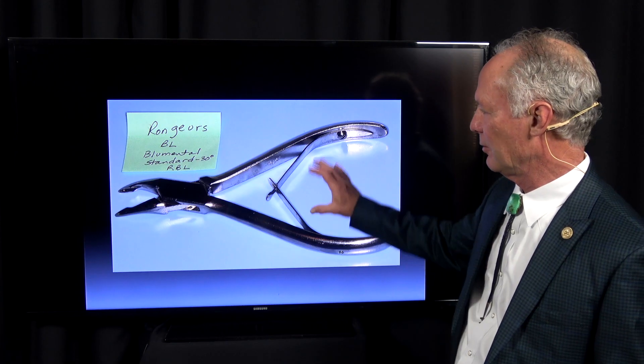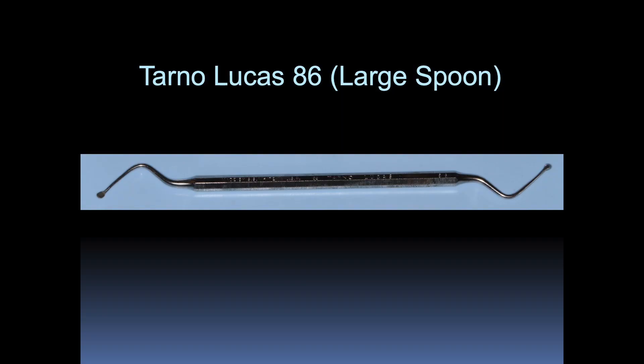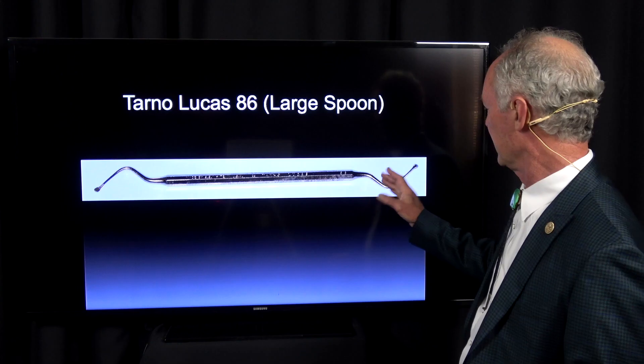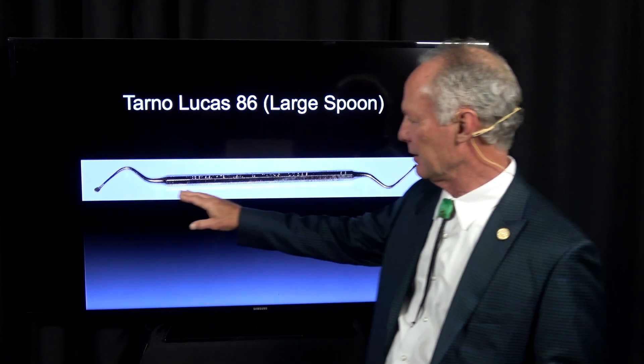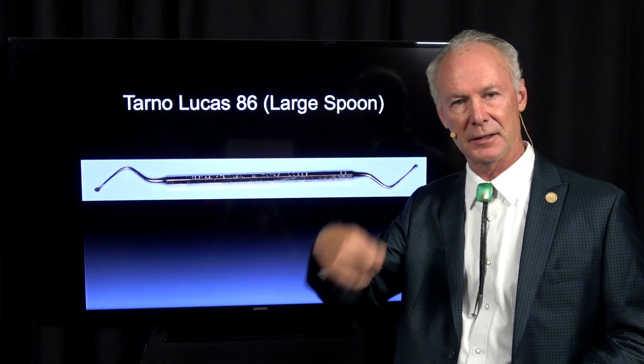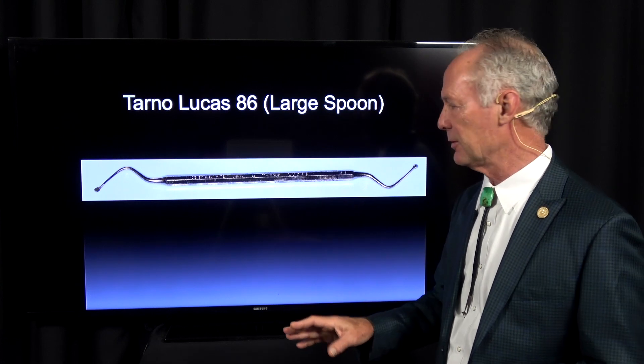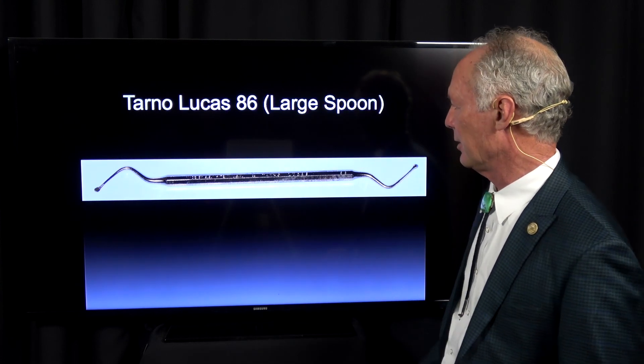Rongeurs — we've got one larger size and one smaller. I usually just have the larger size on the surgical tray. Then this is a large spoon; I want the spoon part of the instrument to be very large so you can curet out sockets. Now you want to be careful about cureting in the mandibular molar area because you don't want to take a chance on damaging the inferior alveolar nerve. It's especially true in the third molar area and especially if they're impacted third molars. But I want this to be a large spoon, not a small spoon.